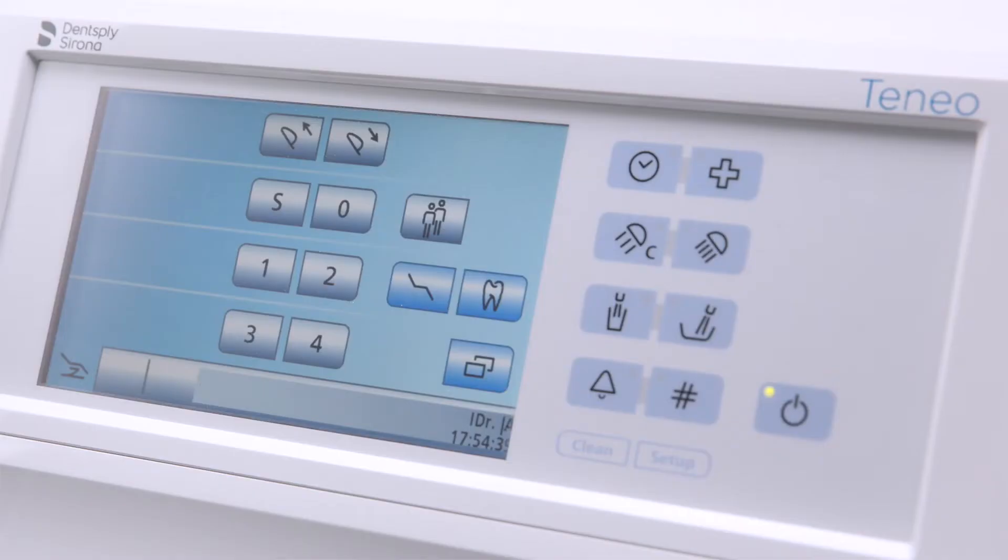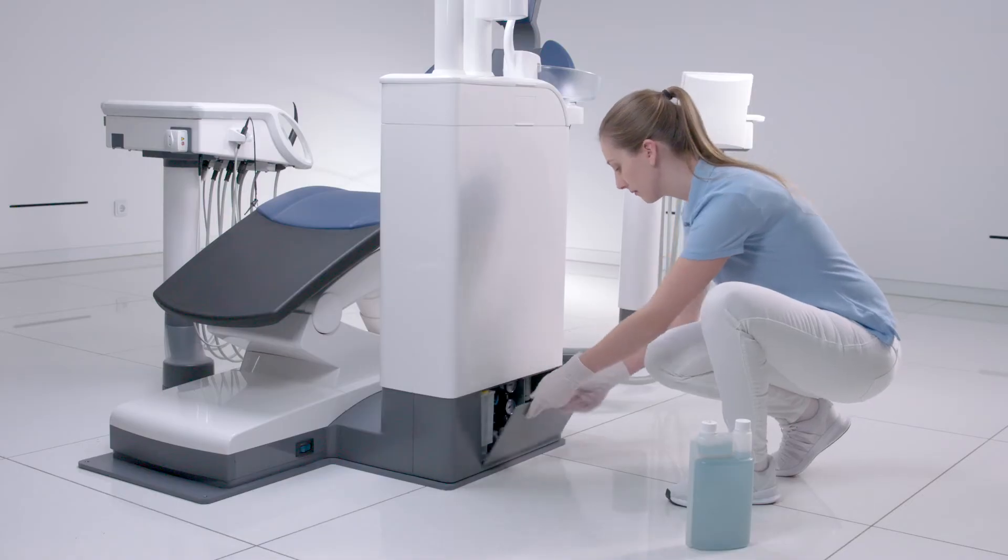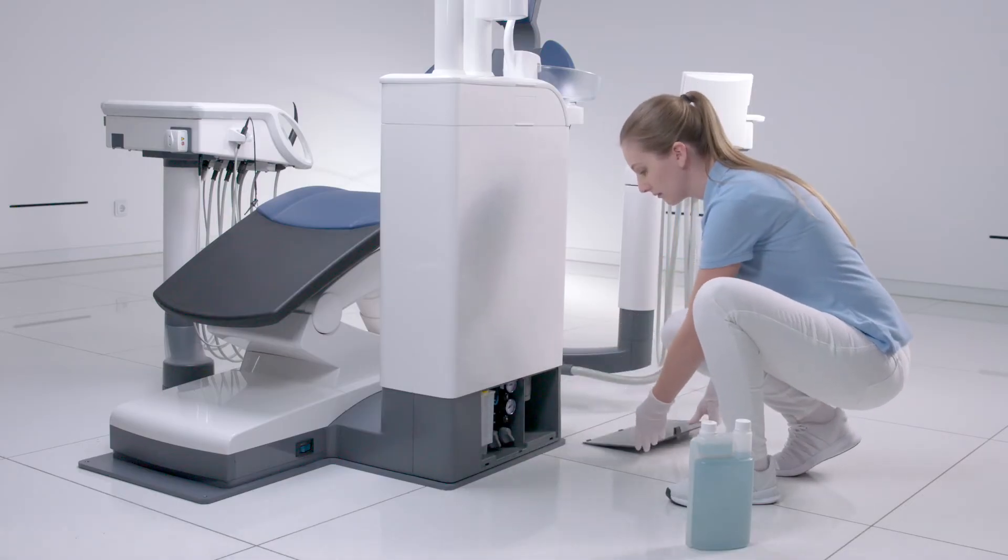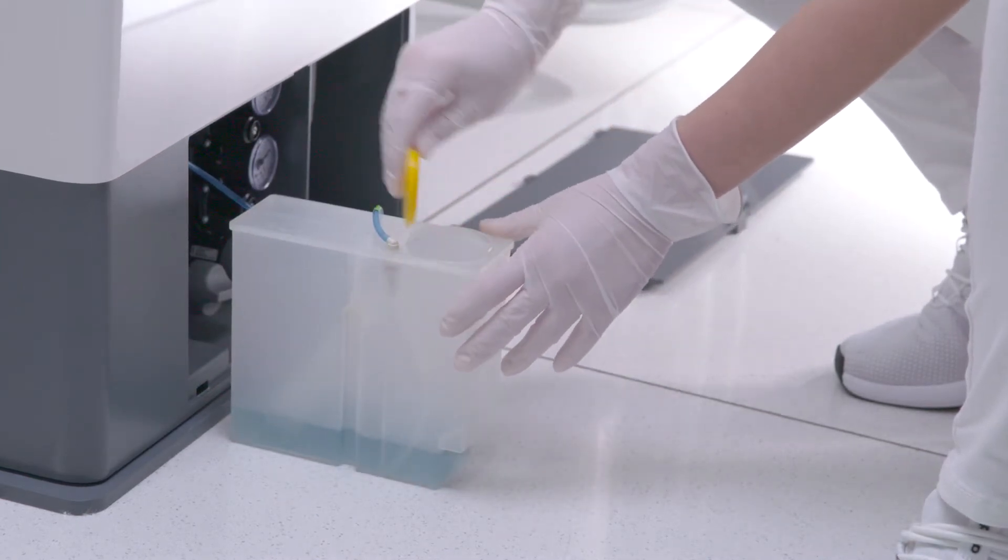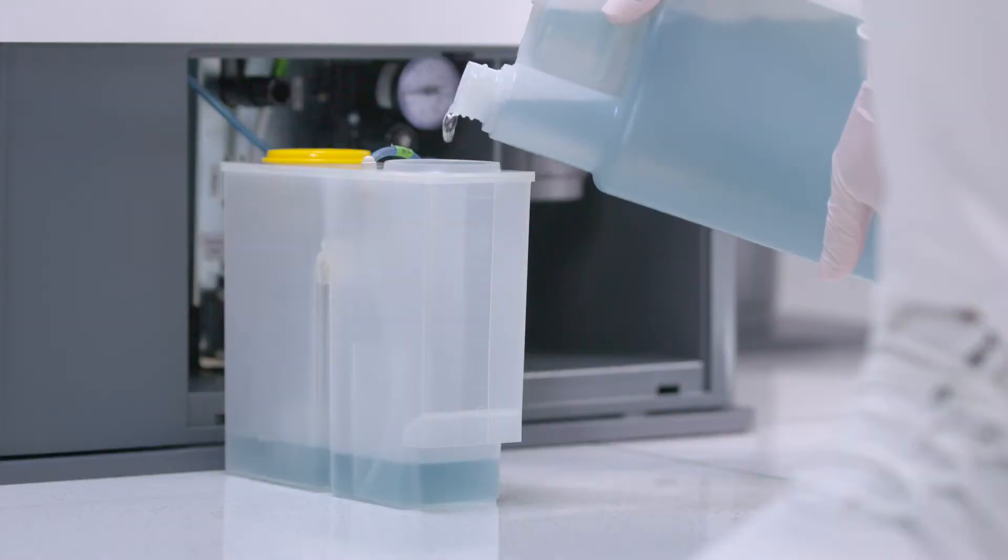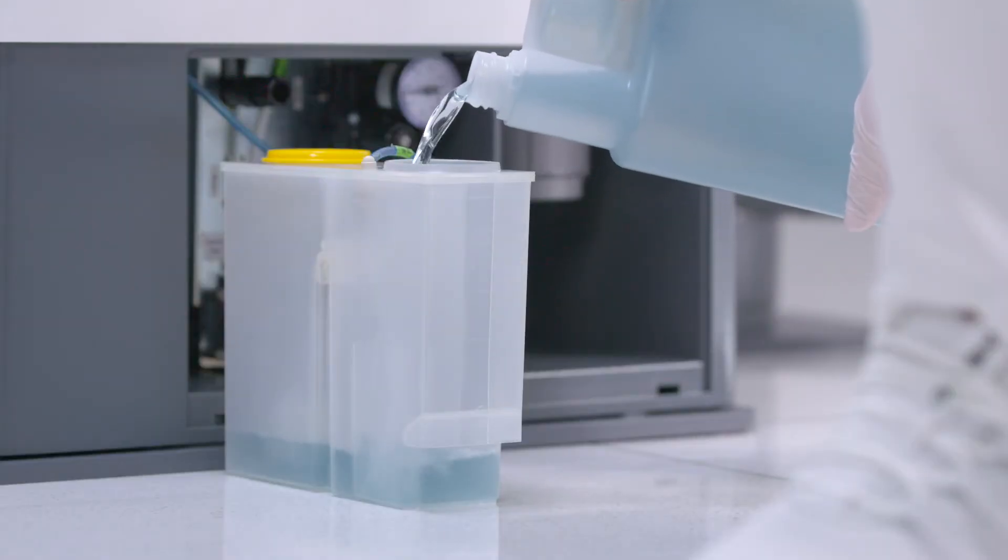If the cleaning agent for cleaning the suction system level is low, CHEM is displayed on the status line of the EasyTouch. Open the flap on the base of the water unit. Pull the tank out of the water unit slightly, paying attention to the hose line. Open the lid on the tank and pour in the cleaning agent.